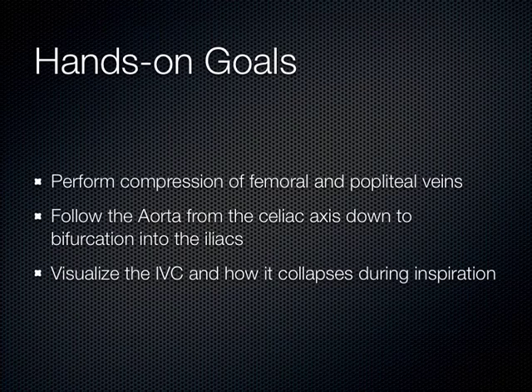So today, with the hands-on session, we're going to do compression of the femoral vein and the popliteal vein. You'll see how fast this goes today. It's going to be a pretty quick scanning session, because you're just compressing the fem area, and then you go down to the pop, and then you follow the aorta down until it bifurcates, and then I want you to look at the IVC and how it collapses during inspiration.